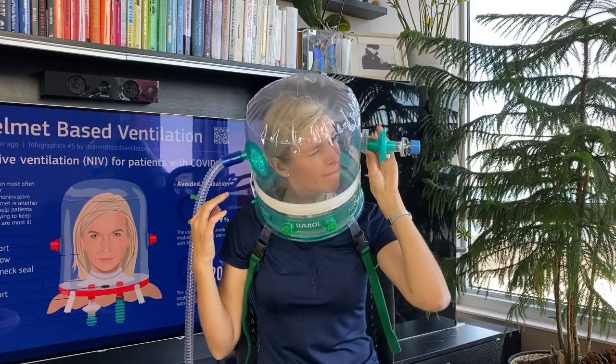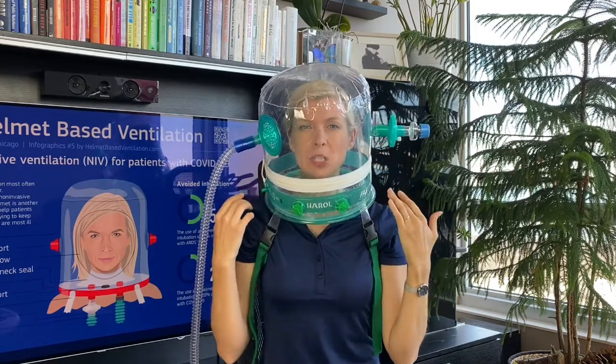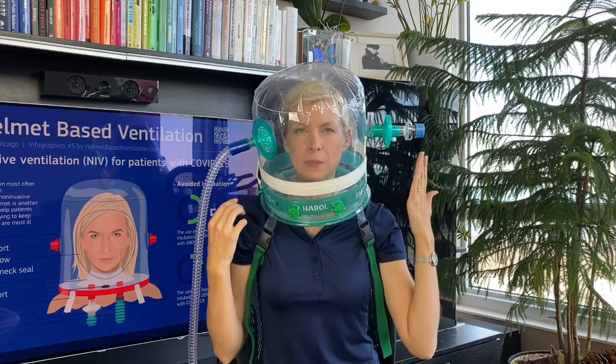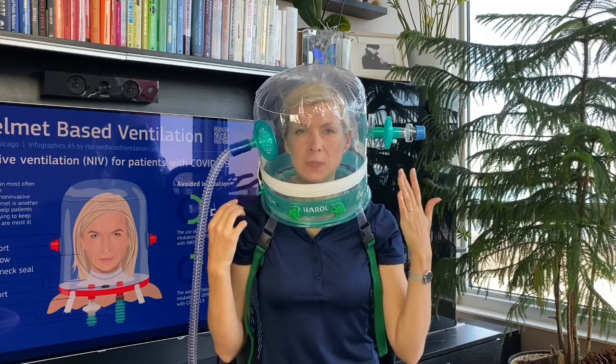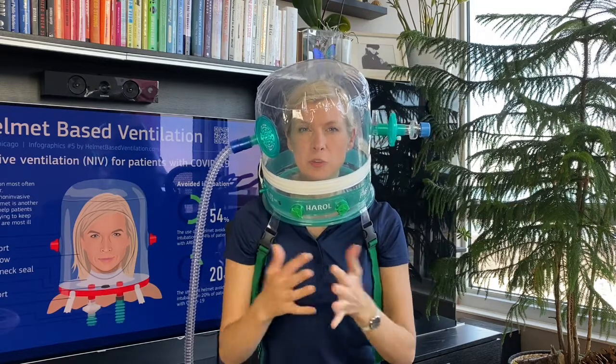Now the manometer — it's showing the pressure inside the helmet is 12 centimeters of water when we set it at 10. The reason is that we are using the antibacterial filter, which adds some pressure — about 2 to 3 centimeters of water will be added if you are using a filter.